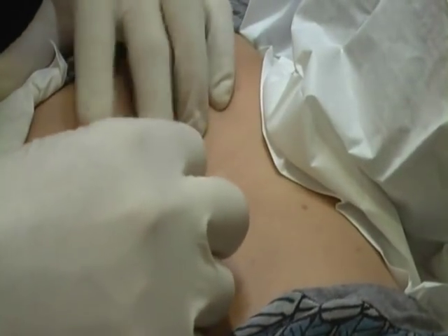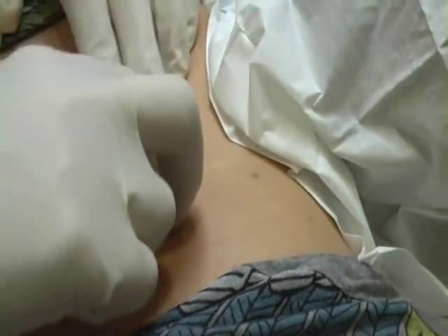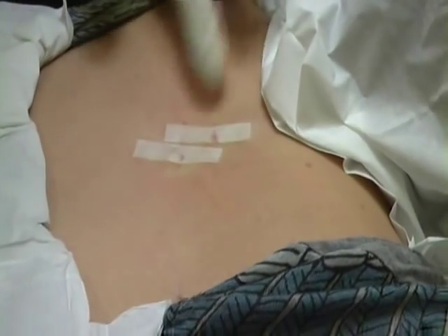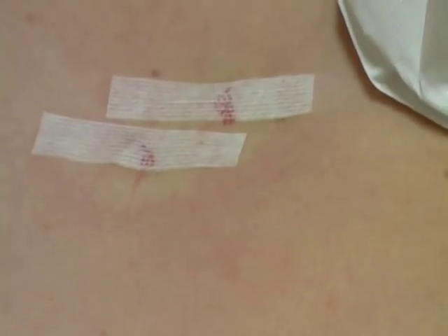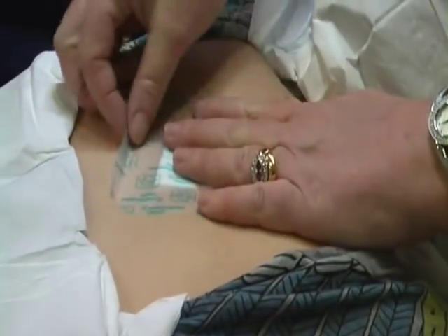Let's have a look. If I sort of stretch them like that and then you just pull it — there's that. And the same we did on the other one. As you can see it's just taking the tension off the skin there by gathering the skin fold up. Those Steri-Strips will sort of loosen over the next five days. Ideally if they could stay on for a week to ten days that would be even better, because the skin on the back is much thicker than the skin in other areas and therefore it takes longer to heal.